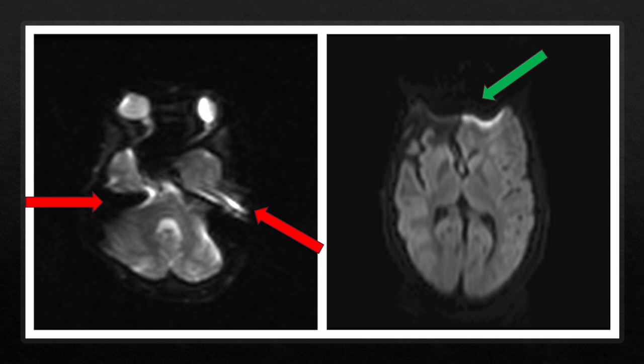When the phase encoding is applied right to left, it is a bit more apparent, as shown by the red arrows. So what we did was shift the phase encoding for this scenario, and that artifact does still appear, shown there on the second image on the right with the green arrow. But applying it in this direction, we maintain the symmetry of the brain, and the artifact is still there, but it's not as disruptive to areas that are really important when we're looking at the tracts, when we're acquiring the DTI images. So although still there, it's not as disruptive.